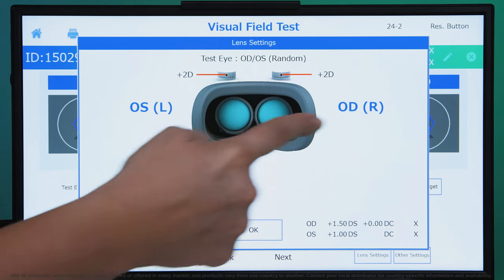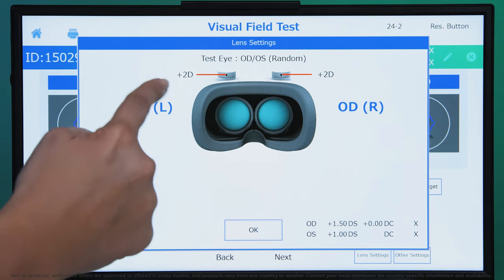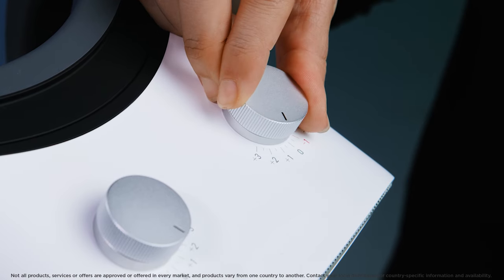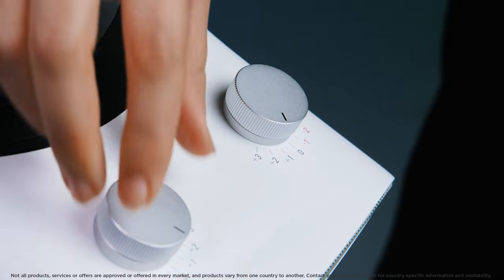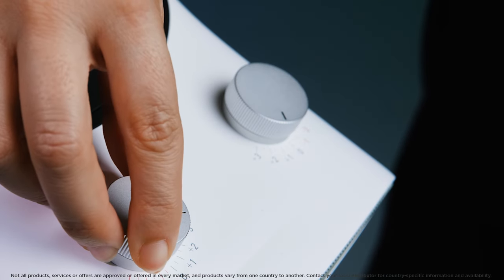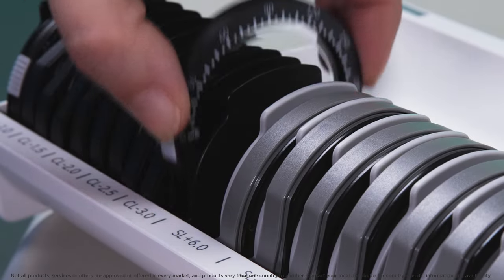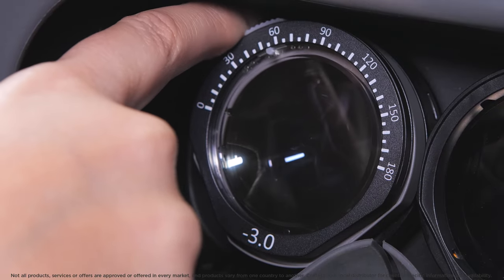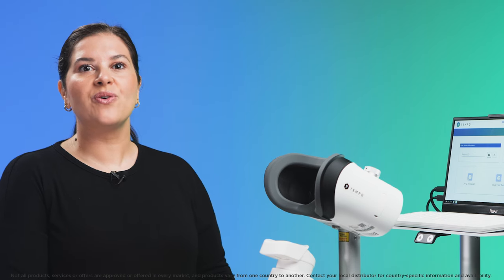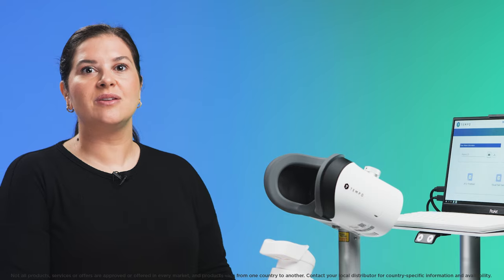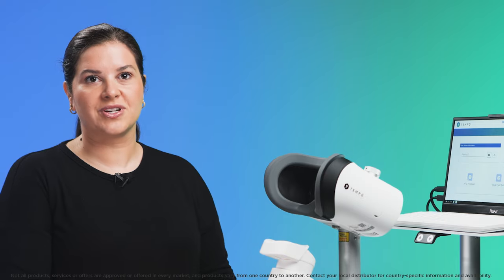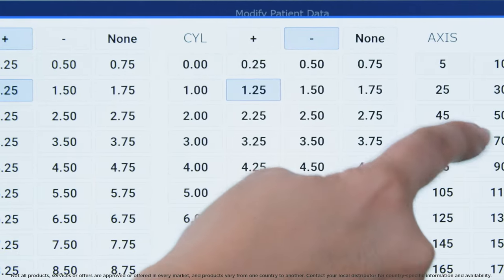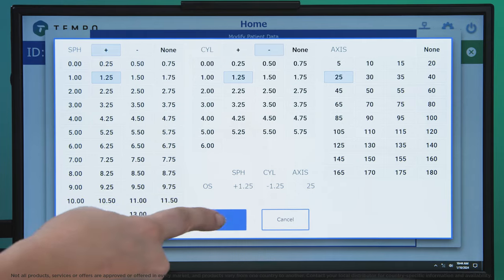The screen tells you exactly how to correct the prescription prior to testing. Correct the prescription through a combination of turning the dials on top of the headset and adding auxiliary lenses if indicated. For more information, watch our short video on inputting and correcting the prescription. Once the distance prescription has been entered or updated, press OK.